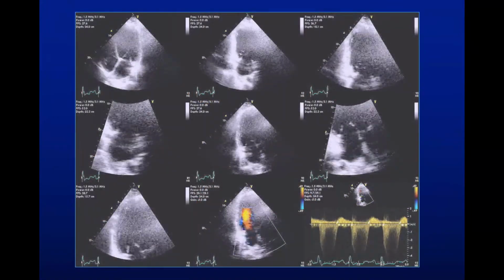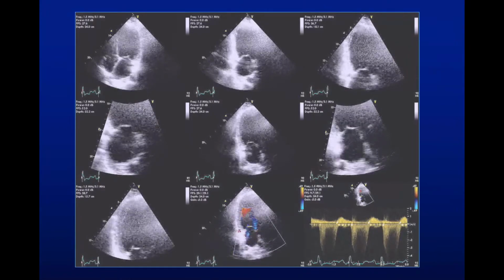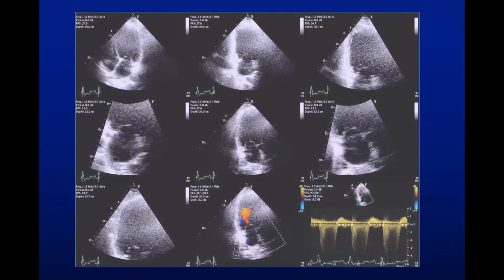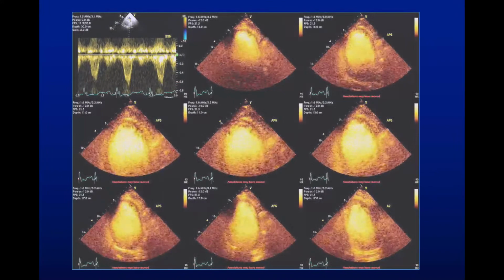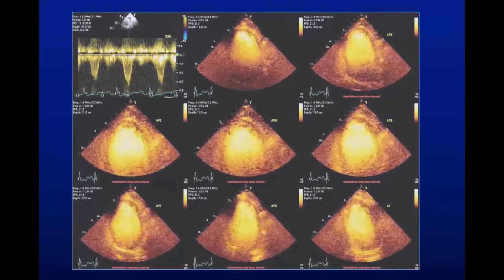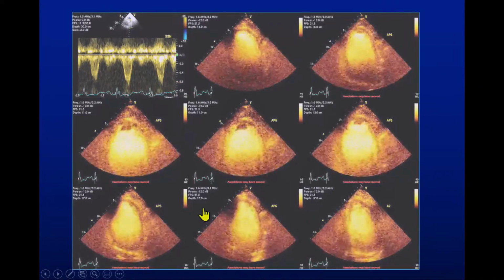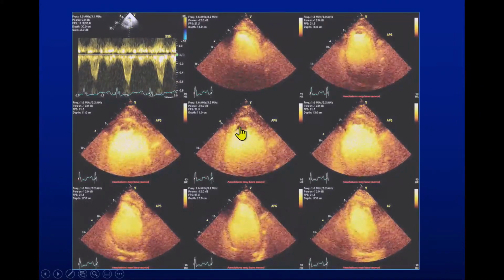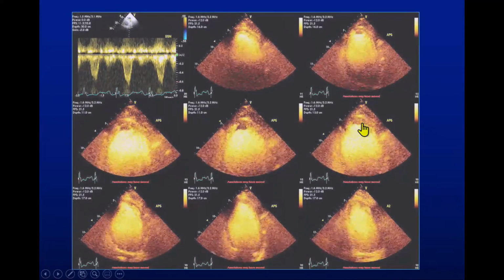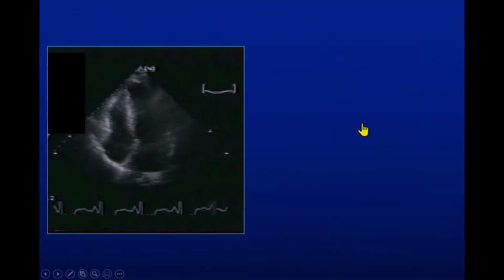Take a look at this case here, a depressed ventricle. Certainly, I think most everybody would agree, we don't see all the walls. We can say globally it's depressed, the ejection fraction is depressed. Cannot say much more really regarding that. And look at, besides depression of ventricular function, I can look at all the regionality, and basically this is diffuse abnormalities except the apex, which is akinetic, and on top of that you see a non-enhancement of this structure, which is a thrombus, which changes obviously the management on such patients, and hopefully you improve outcome by putting them on anticoagulants.